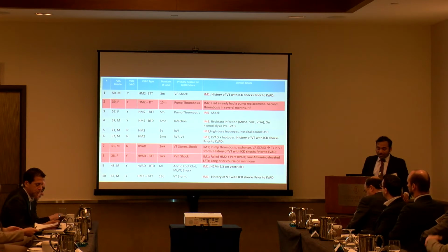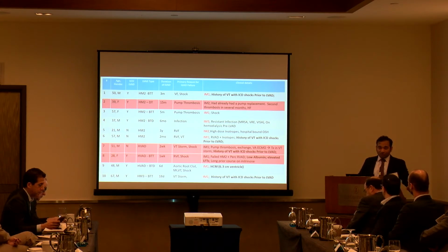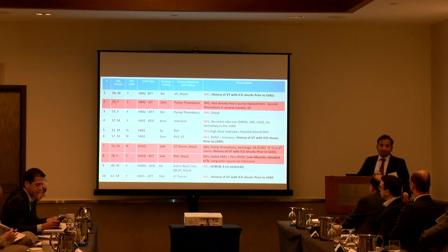One of them, the one that did not do well, came to device therapy after being supported for 2 years with milrinone with the hopes of bridging directly to transplant. Most of those 2 years, she was not listed because of social contraindications, and by the time she clinically collapsed, underwent a VAD implant and a temporary RVAD implant with the hope of bridging her to transplant. Unfortunately, that was not enough to resuscitate her at that time, and a few days later underwent an emergent TAH implantation, but at that point in time was too far along and died soon afterwards.